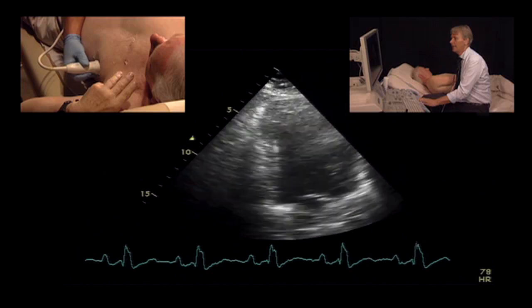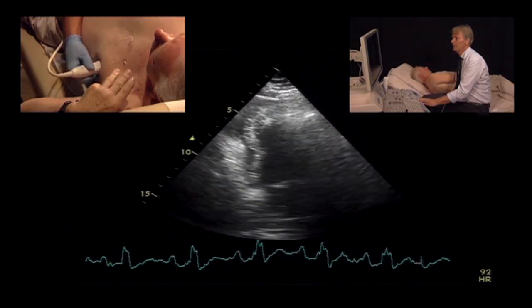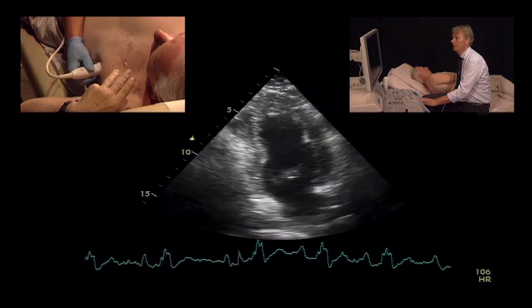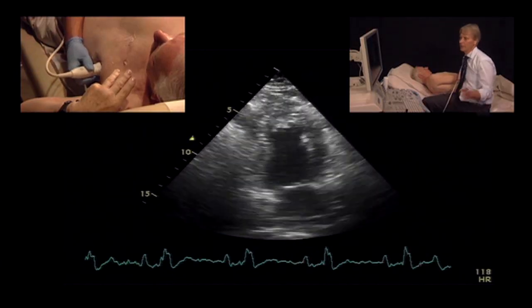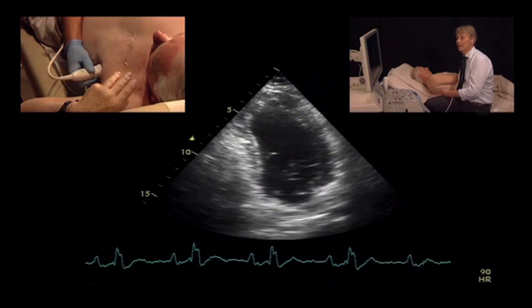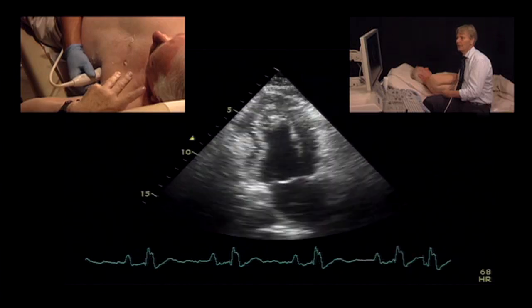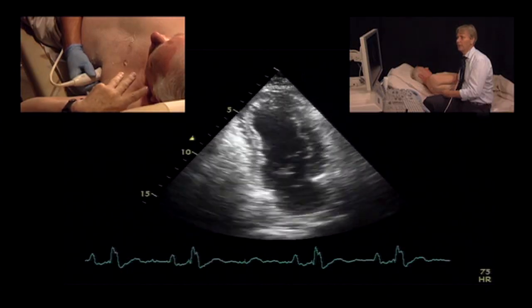inhale. Können Sie mal einatmen? See, and immediately we get, das ist zu viel, ein bisschen ausatmen. We get better image quality. Sometimes he should not excessively inhale, as in this case, but if he inhales moderately, you can see the anterior and the posterior wall much better.